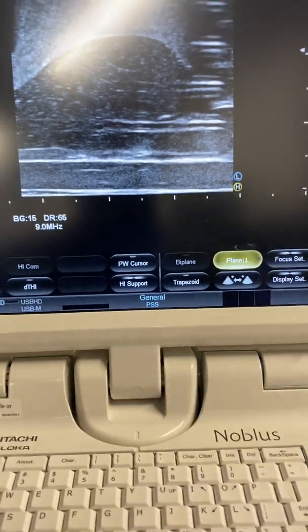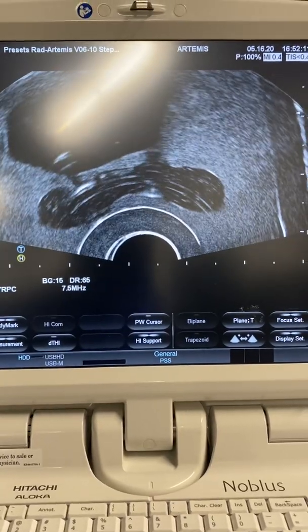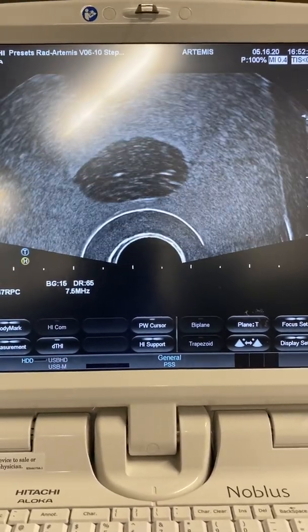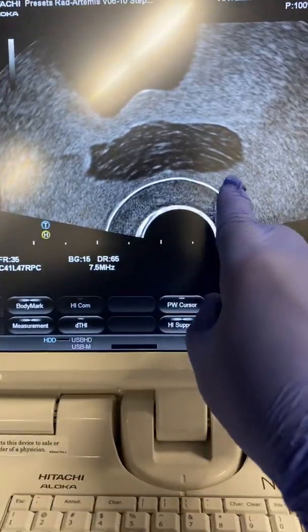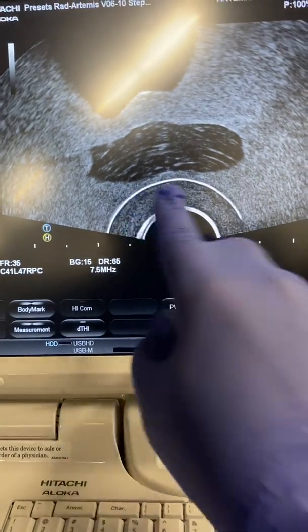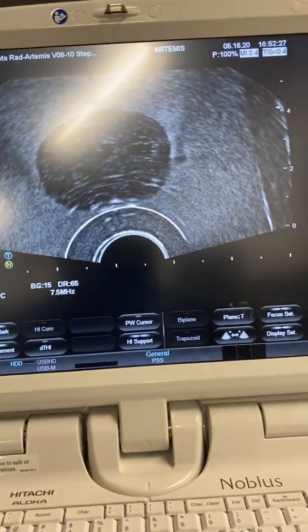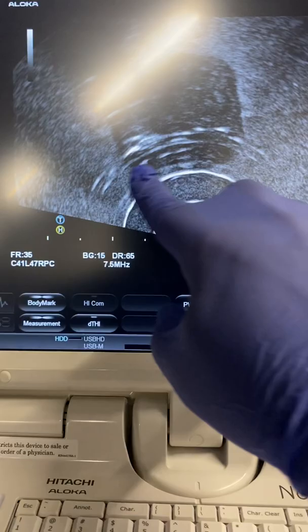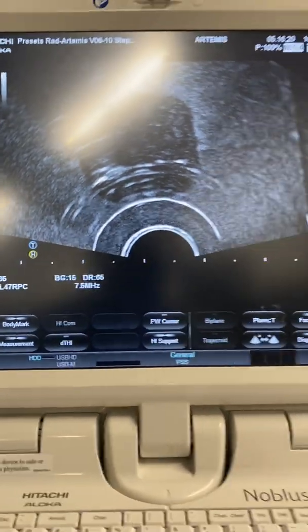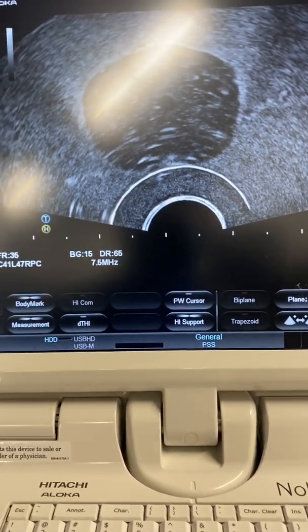Then they'll have you go to axial. Starting at the SV and stepping out slowly, you're going to see the gel. They're checking to see if it covered left and right equally. You'll go from base, slowly through mid-gland, all the way to the apex, making sure there's coverage all the way through and on both sides of the gland. Do a nice shot at mid-gland for them, print that using record three, so they have a pre and post of both sagittal and axial.